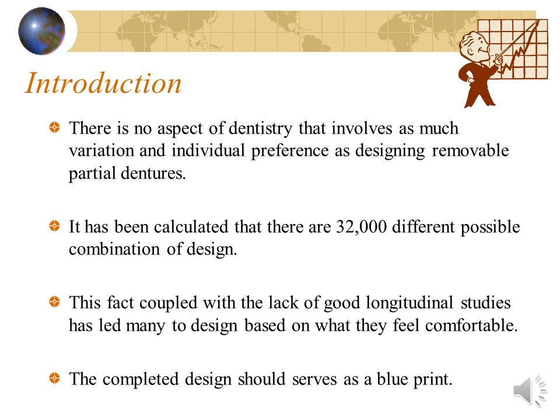is no aspect of dentistry that involves as much variation and individual preferences as designing a removable partial denture. It has been calculated that there are 32,000 different possible combinations of RPD designs. Besides the fact that designing requires use of remaining teeth, surrounding tissues, and consequently demands appropriate application of knowledge and critical thinking to ensure the best possible outcome given the patient's need and desire.